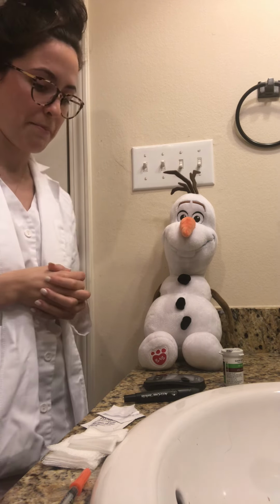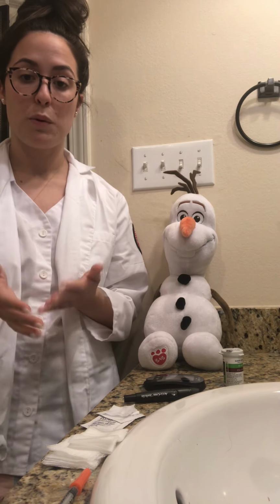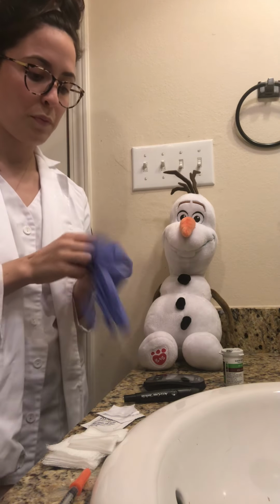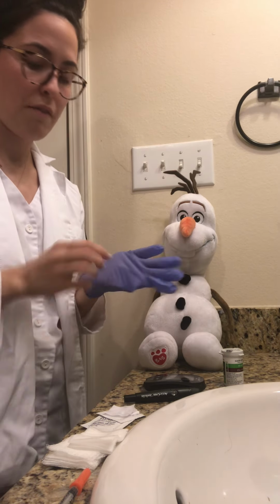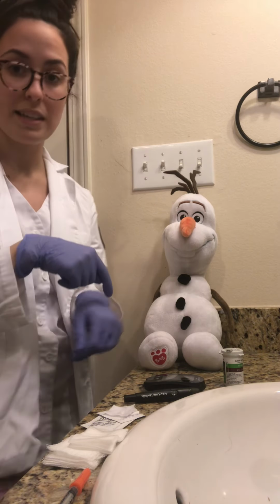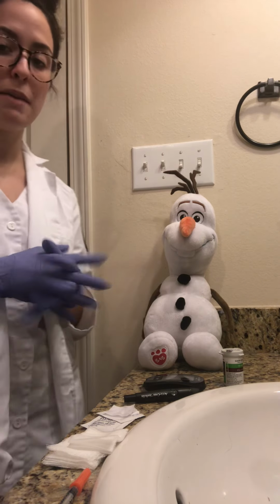Okay, great. So like I said, I did perform hand hygiene upon entering the room, so I'm going to don some gloves. All right, and Mr. Olaf, can I get you to verify your name and date of birth? I'm just going to check the bracelet to compare. All right, great, everything matches up.